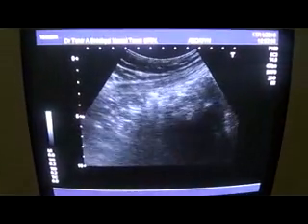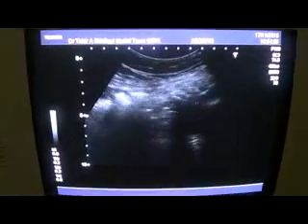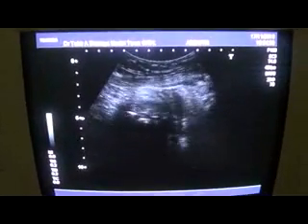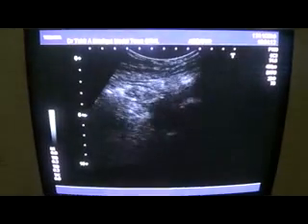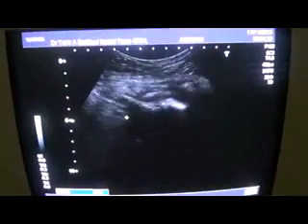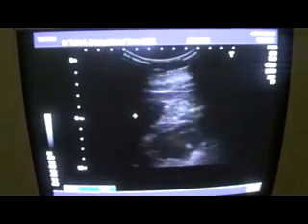Now you see that these are adjacent vessels, and the adjacent vessels do not show any significant movement. Now you see that this segment of the vessel is not showing some movement, but anyways, so this is the cause of all the above mentioned pathology.